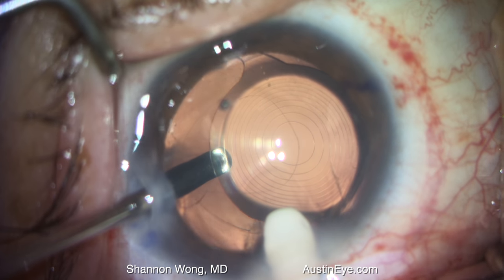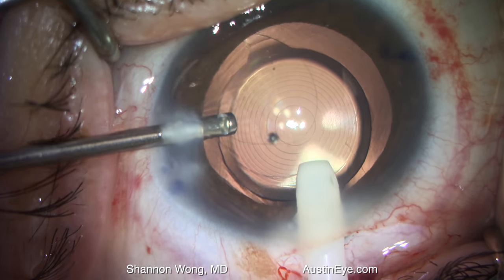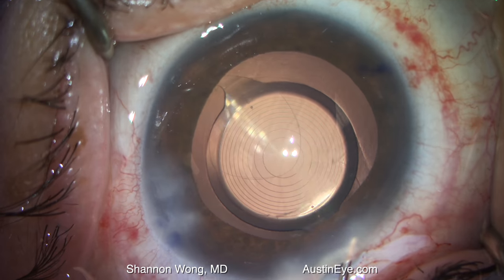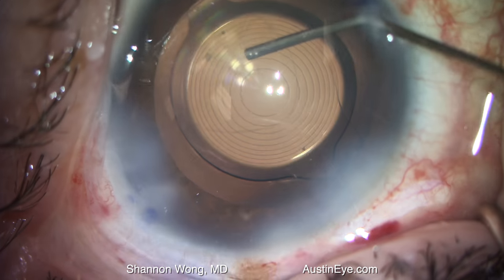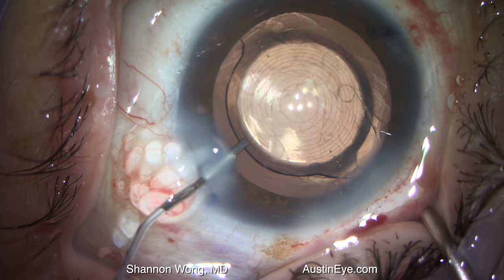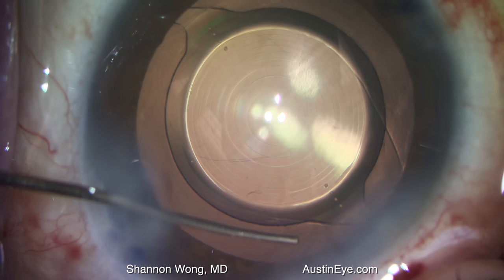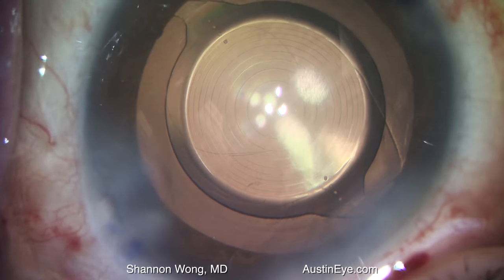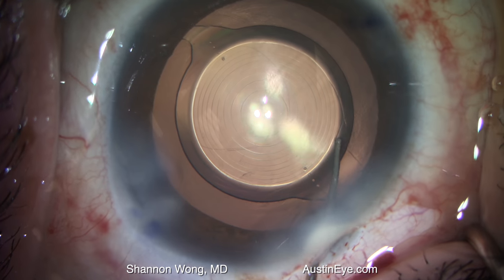We used a bimanual technique where I placed the infusion through one incision and the vitrector through a second incision. The lens implant is currently in proper alignment, but the optic on the screen left is not quite perfectly positioned within the capsular bag. So we placed some Healon GV viscoelastic to stabilize the anterior chamber, and then used a cyclo-dialysis spatula to gently reposition the anterior capsule leaflet over the optic to ensure the optic is completely encapsulated within the bag.